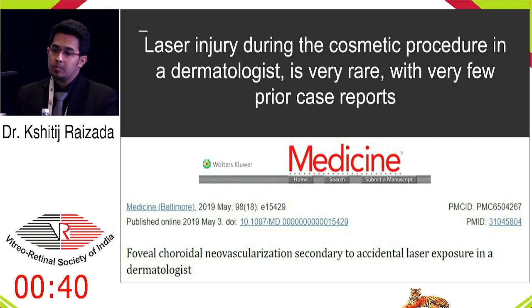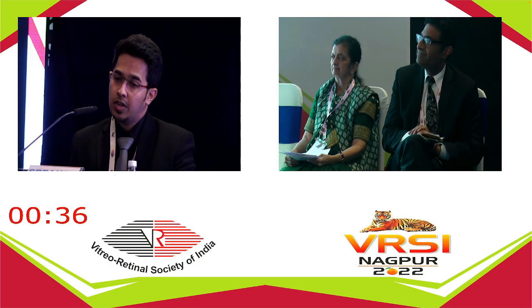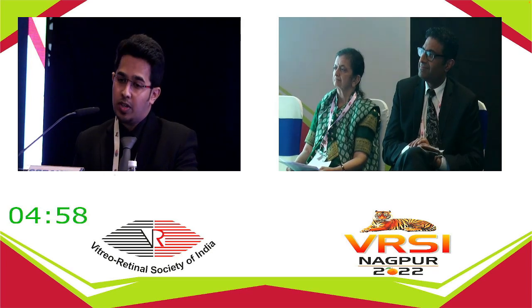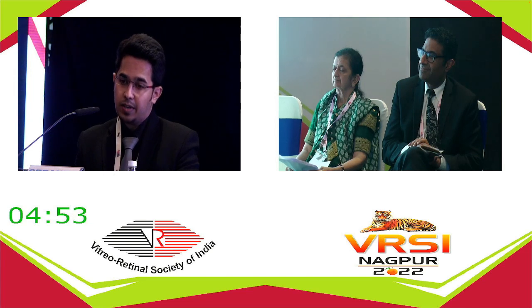Thank you so much. I just had one question. Did you augment the laser inferiorly as well? Yes, sir, I did, in the subsequent visit. In the first visit, there was a downflowing stream of blood, so barraging that part of the hole wasn't possible. But one week later, I did barrage it completely. Right. Thanks so much.